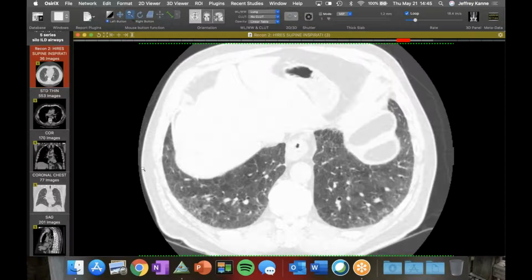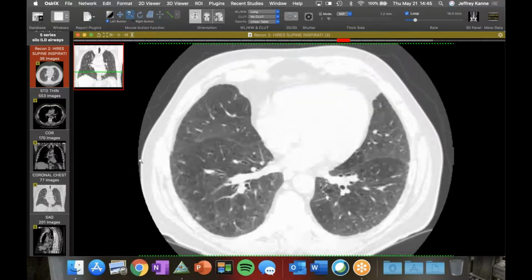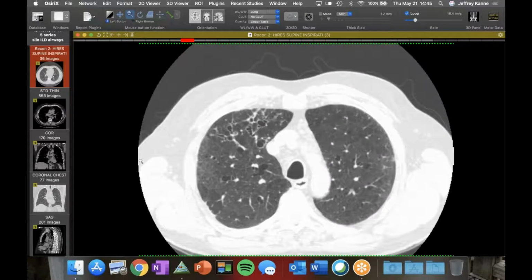But yeah, I just haven't seen a silo fillers in a really long time. Even though there's a lot of it in agriculture, I think it's because most people are very aware that the gases and the silage can be quite damaging to the lung. But this showed really impressive airway findings. I think the fibrosis is completely unrelated, and as far as I know, he's a never smoker, so more likely to be related to just chronic dust exposures on a farm, and we see that not insignificantly.